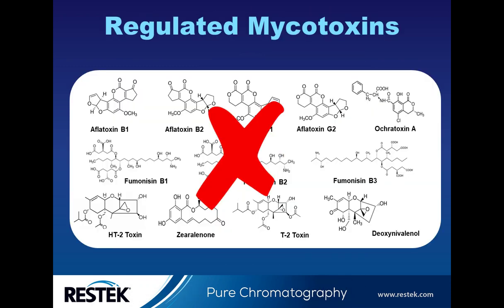With those questions in mind, I first found the 12 most regulated mycotoxins from literature and published work. Here are the chemical structures of those 12 chemicals. As we can see, they are all small molecules, polar, chemically stable, and also temperature resistant.